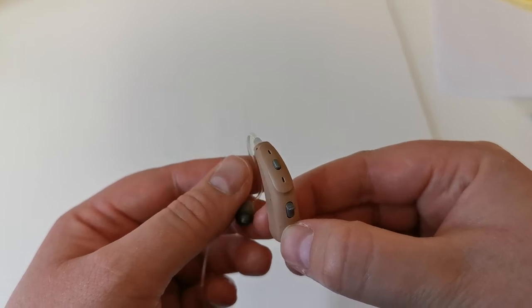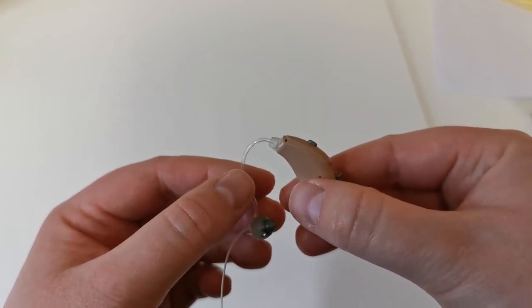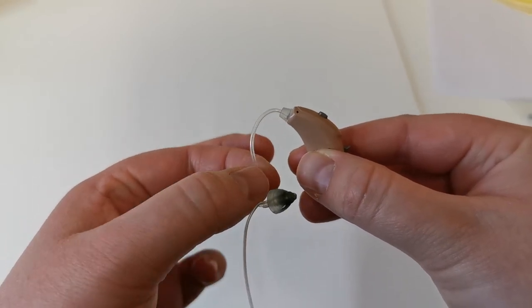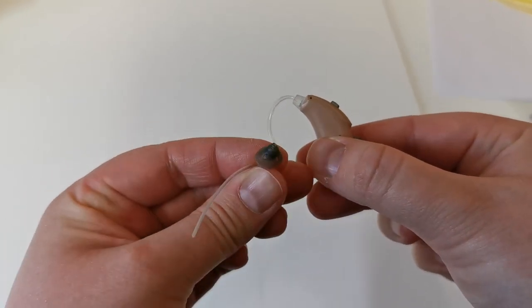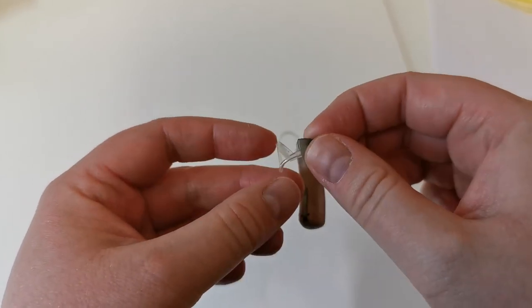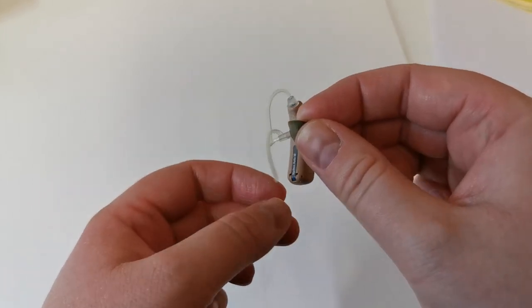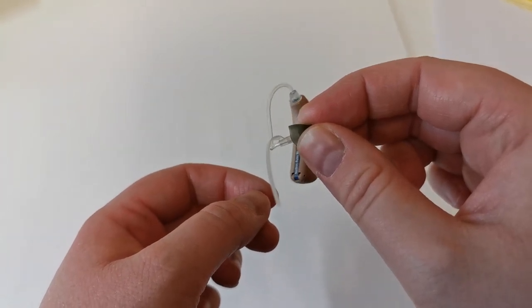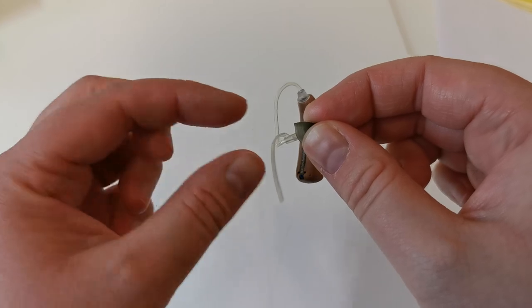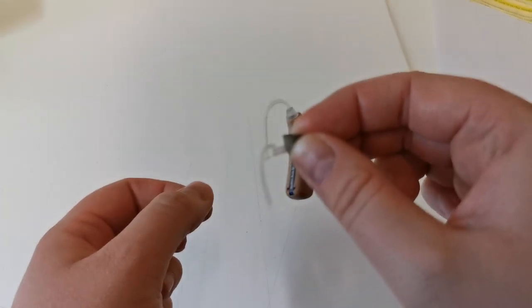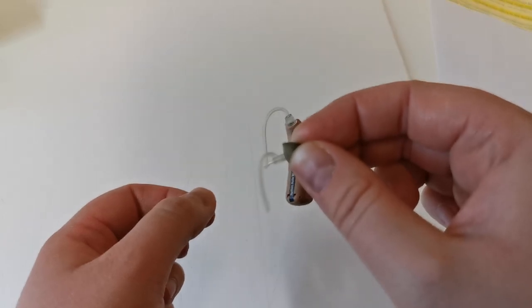The sound travels from the base part of the hearing aid through the tubing. The black dome is what goes in the ear and the plastic strip sits into the bowl of the ear. We call it the anchor. This is what your hearing aid looks like.